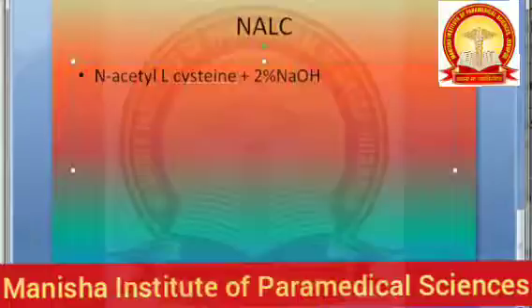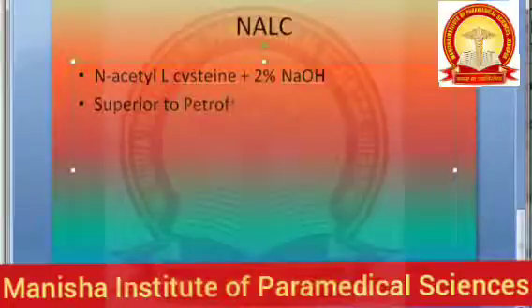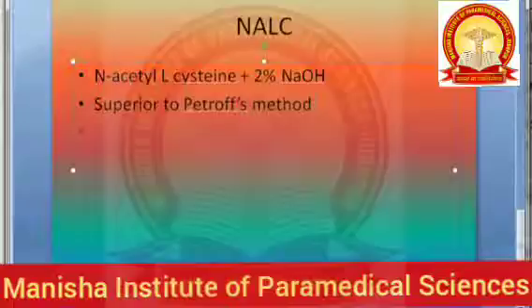Here the NaOH percentage, you see, is 2%. This is superior to Petrov's method for isolation. This is better. For isolation, it is superior, we are saying.